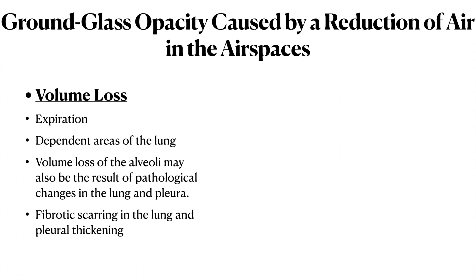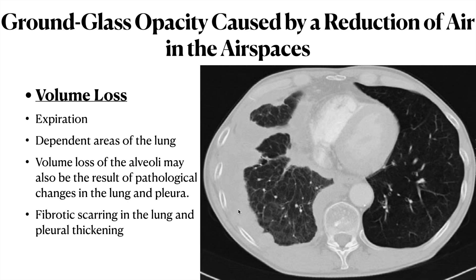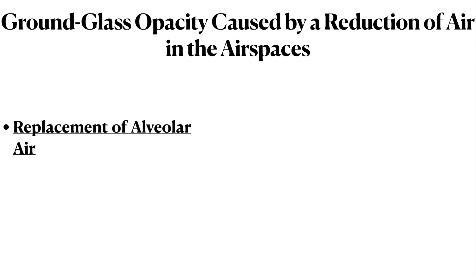Fibrotic scarring and pleural thickening can be a cause of volume loss. Here you can see pathology in the pleura preventing the lung from fully opening up. Comparing both lungs, there is increased attenuation in one part, meaning that particular lung is unable to expand fully and there is a reduction in air in the air spaces — that is the reason for this diffuse ground glassing.